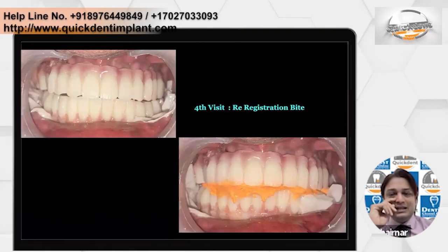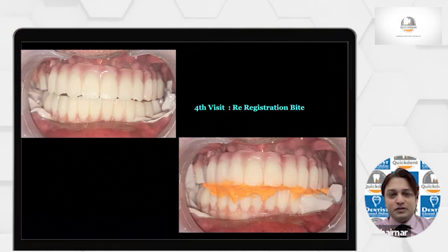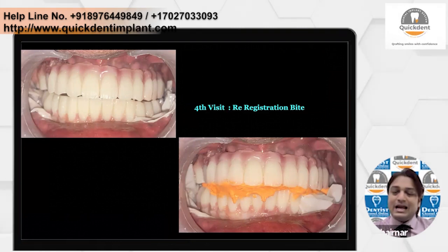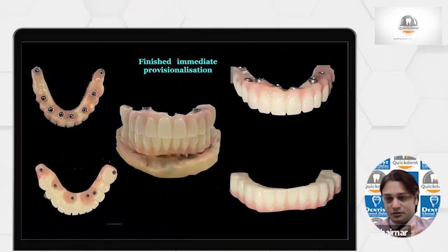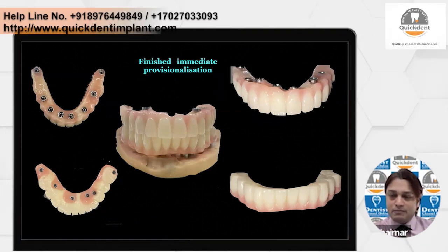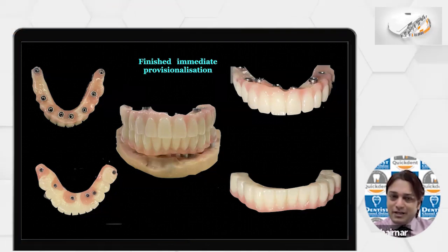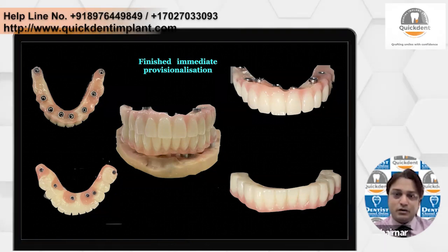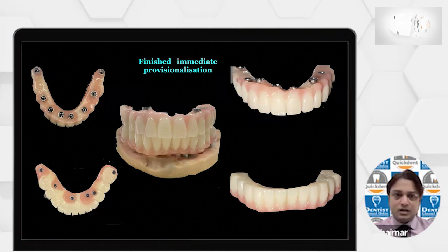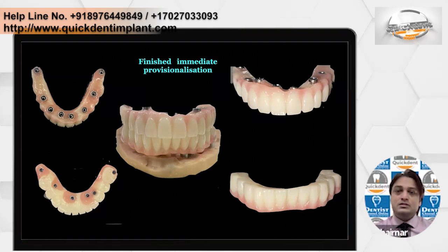And now, because there will be a little bit of bite discrepancy, we will retake the bite. And of course, because we are catching it, the undersurface of the prosthesis will be very poor. So we will remove it and send it to the technician to improve the undersurface and reinforce the prosthesis. While trimming and catching with the titanium cylinder, certain parts will be broken, so we need to replace and reinforce with regular acrylic resin. That's why on the palatal and lingual side you can see the pink resin. That is nothing but him improving the strength of the prosthesis. Now this is delivered to the patient.